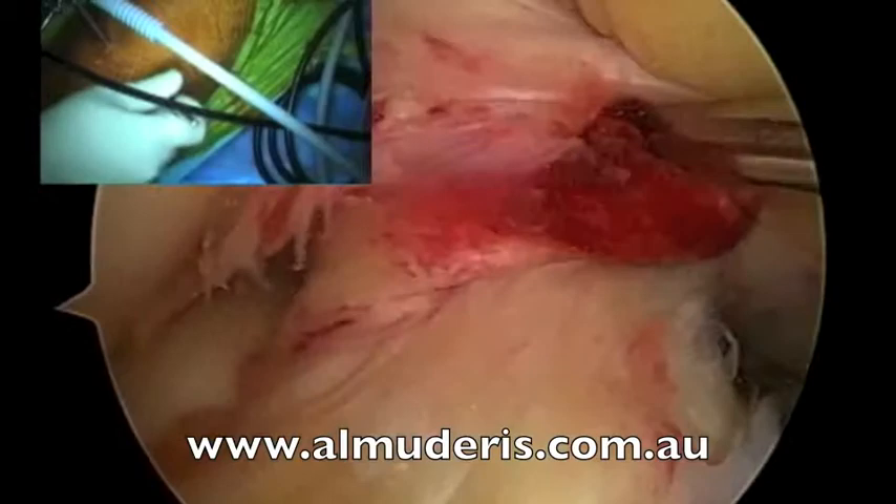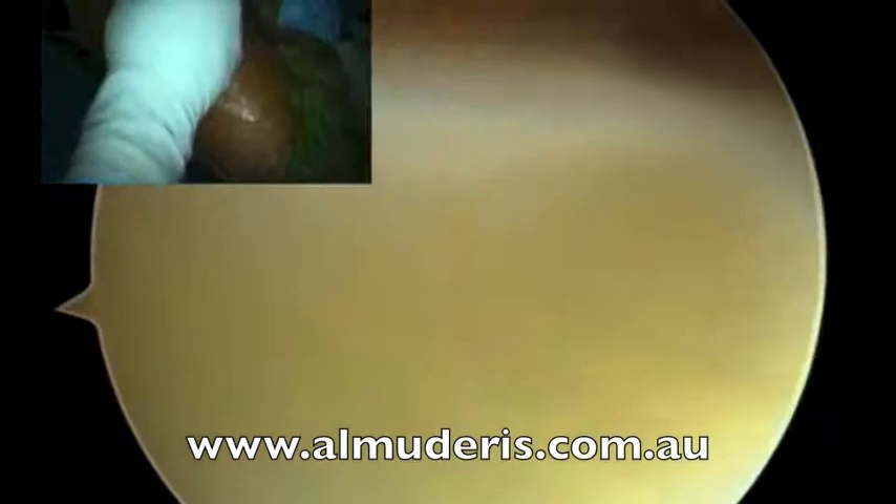These are the ACL fibres. You can see that they are torn. Figure of 4.